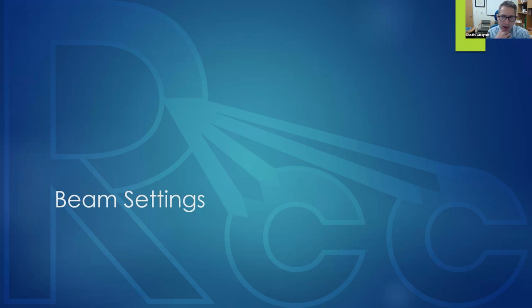The only other thing I'll add is that a lot of new linear accelerators come with surface imaging, and bolus placed at sim. I won't go into the details, but it can be a little bit trickier to use surface imaging when you've placed bolus at simulation and you have to modify your setup strategies with surface imaging. But that's more of a minor concern.